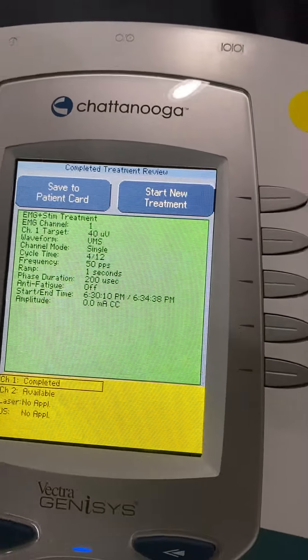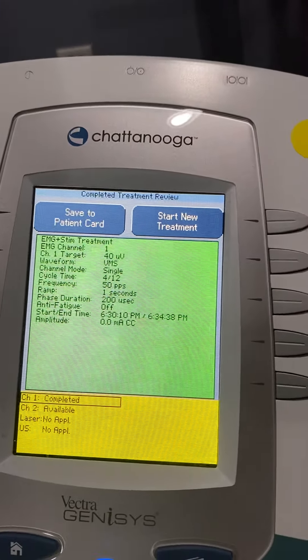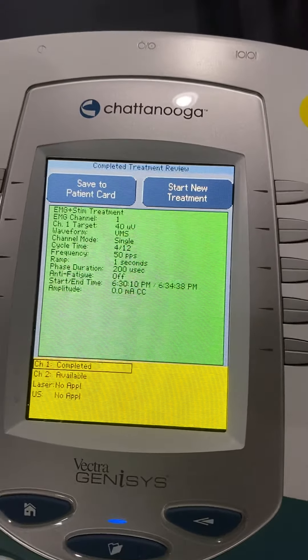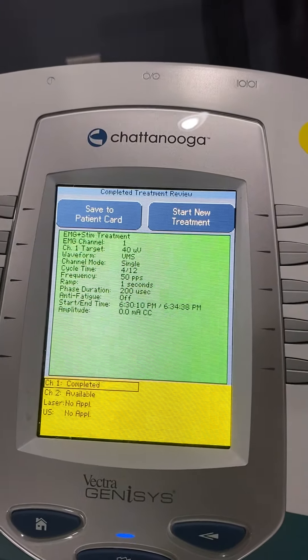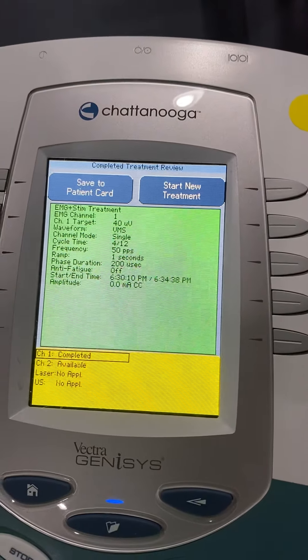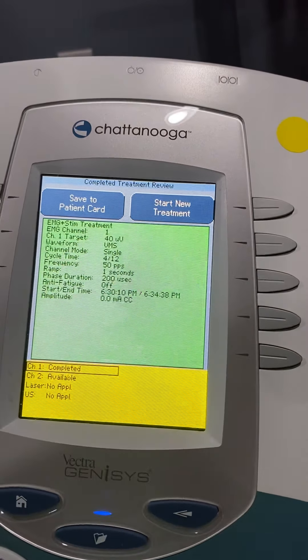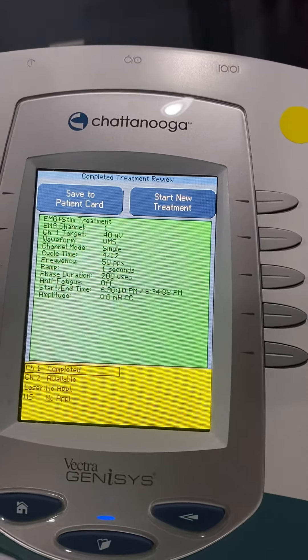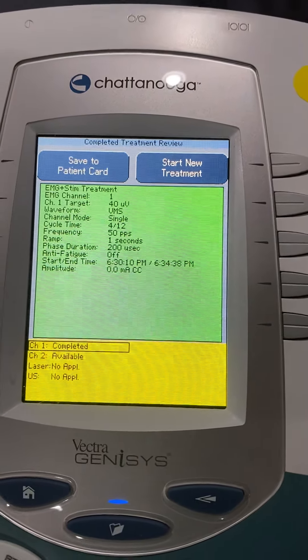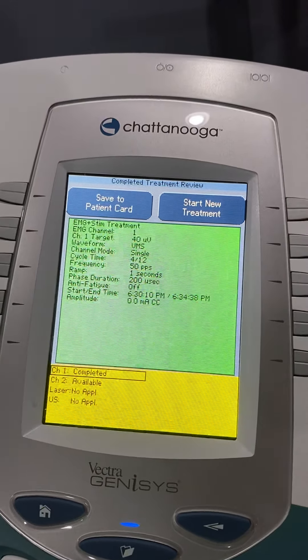For strengthening, we want a fairly high target or threshold that the patient is trying to achieve. This machine doesn't let us set sensitivity, but if it did, we would set sensitivity medium to low. We don't want the machine to act like a microphone — we don't want it to amplify the muscle activation. We want her to work really hard before she gets any credit.